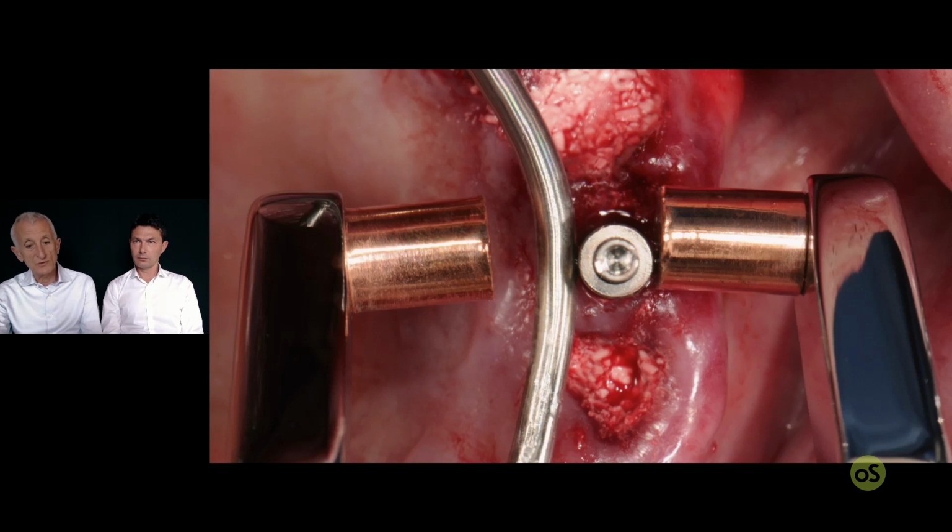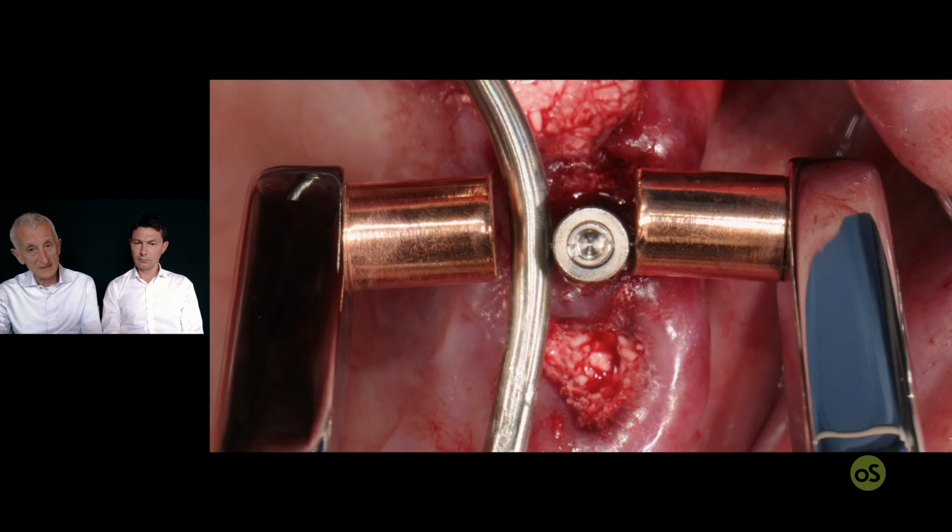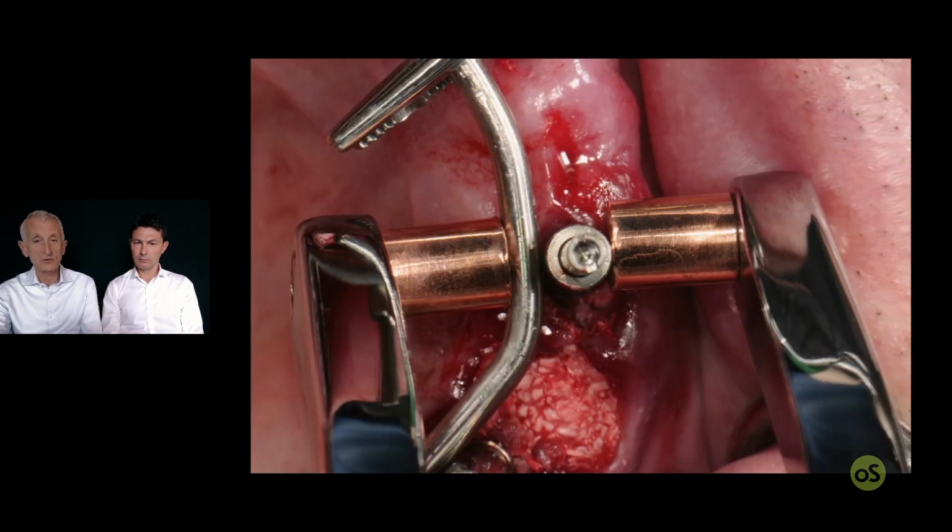Then remember to release completely the clamp. Don't hold this. Let the clamp do the job for you. So this is not released completely yet, not yet again, and this is now completely released.